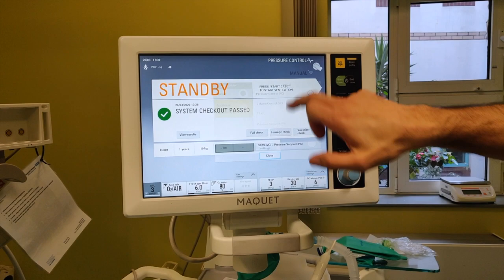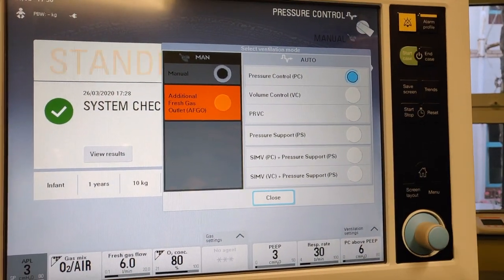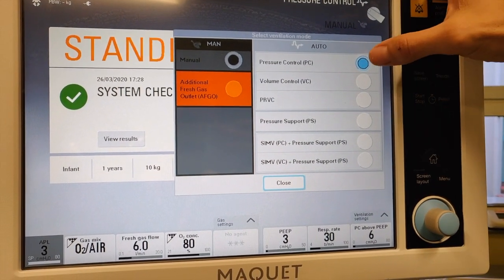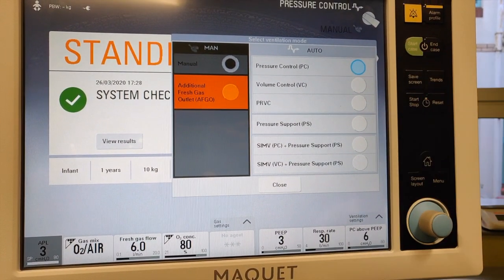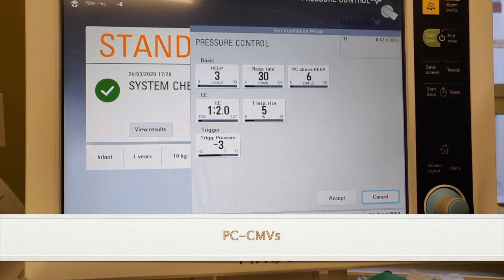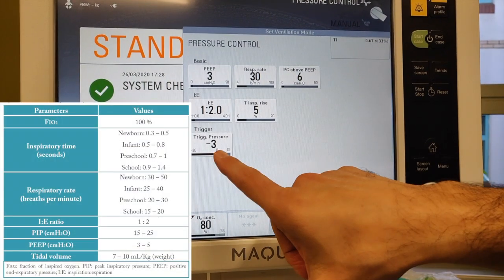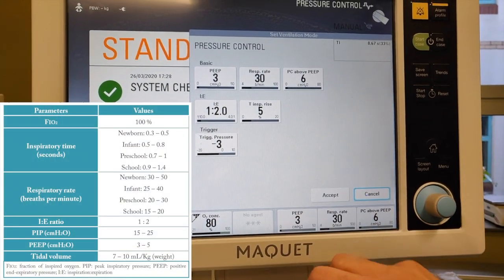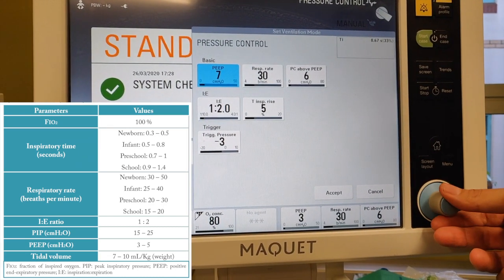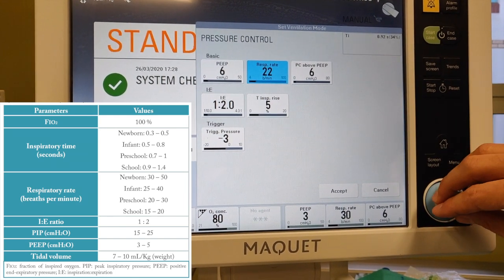Ventilation modes — if you hit pressure control at the top, it gives you a choice of modes, and these are pretty similar to what we've got on the Servo-i and Servo-U. I'm going to go for pressure control to start with and it will bring up the settings. The settings are all set up in anaesthetic land fashion — for instance, they don't want their patients to trigger generally. So you're going to have to go through and put some sensible settings in. PIPs starting at 8, respiratory rate's too high for my patients, so bring it down a bit.